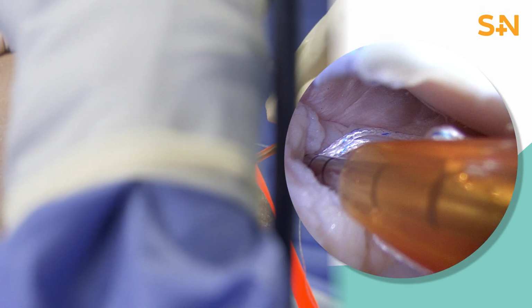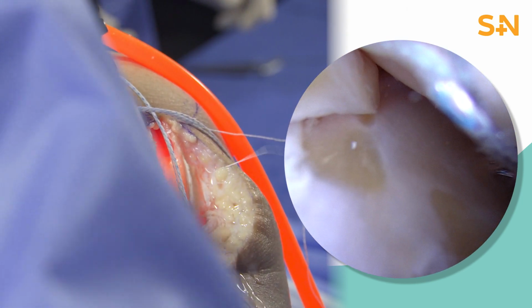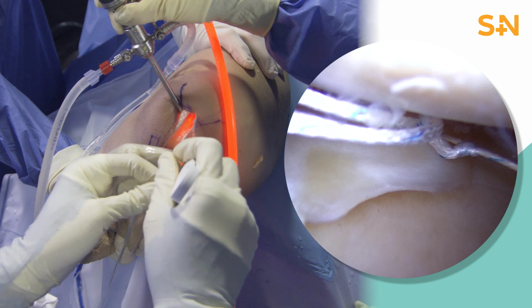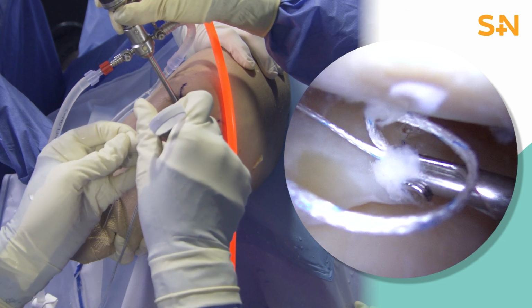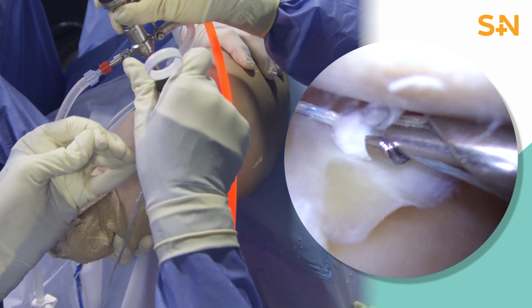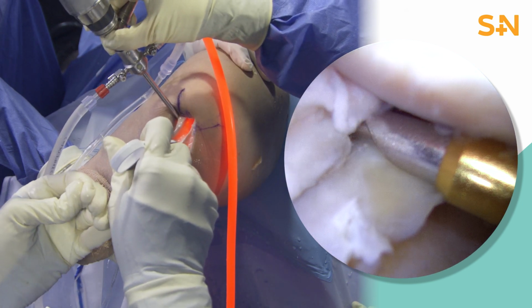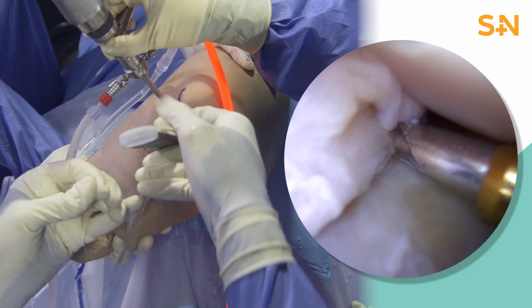If the meniscotibial ligament is visualized at this point, in a distal position, it can be grasped from a posterior medial portal, elevating the meniscotibial ligament. The delivery needle is then removed from the knee, pulling the free end of the suture out of the joint. The free end of the suture is pulled perpendicularly to advance the sliding knot and reduce the meniscal tear.